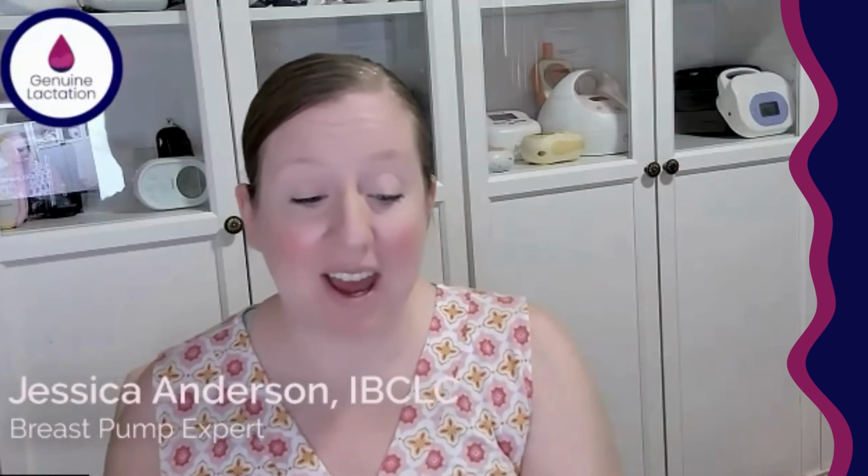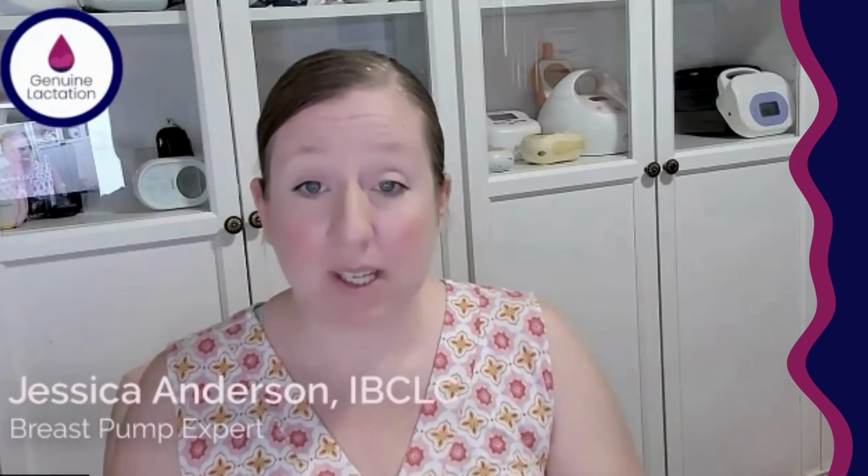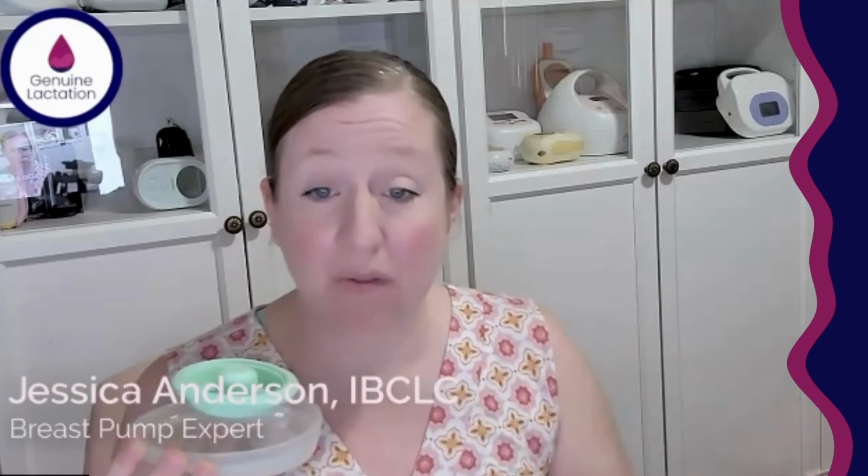We did find that, let me pull this out so you can see it. The duckbill that this comes with sits internally. So you've got your connector there, and this duckbill is actually sitting inside of that tunnel. For a while, we had to use duckbills that sat on the outside that were actually designed for the Freemie cups. They worked well enough, but they weren't a great fit. They were just a solution to a problem.